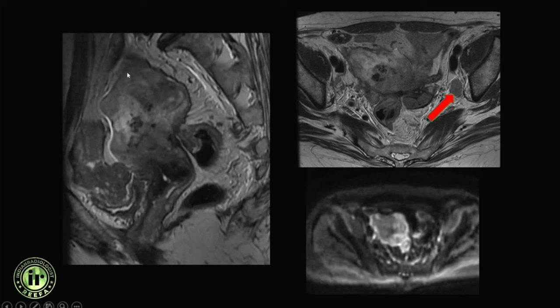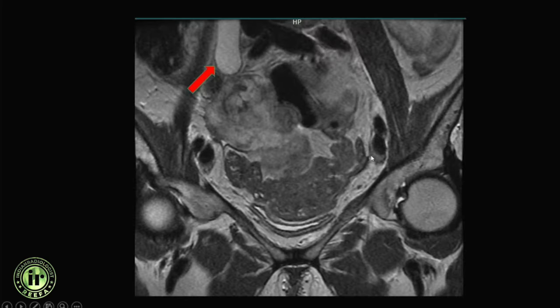A second, more aggressive case: the serosal margins were quite irregular. It had been identified as a fibroid two years prior on ultrasound and showed interval size increase, prompting MRI. The lesion had irregular margins, restricted diffusion, and necrosis. Multiple pelvic nodes were associated. Additionally, there was hydroureter, indicating the lesion was encasing the terminal ureter — features of aggressive leiomyosarcoma.